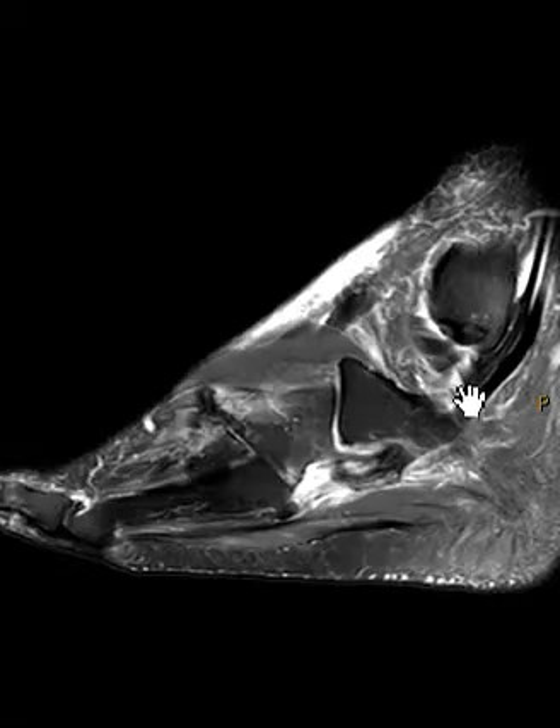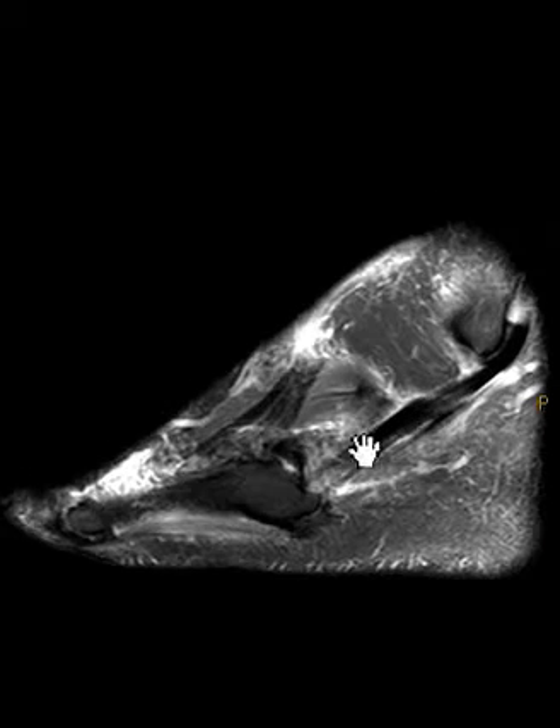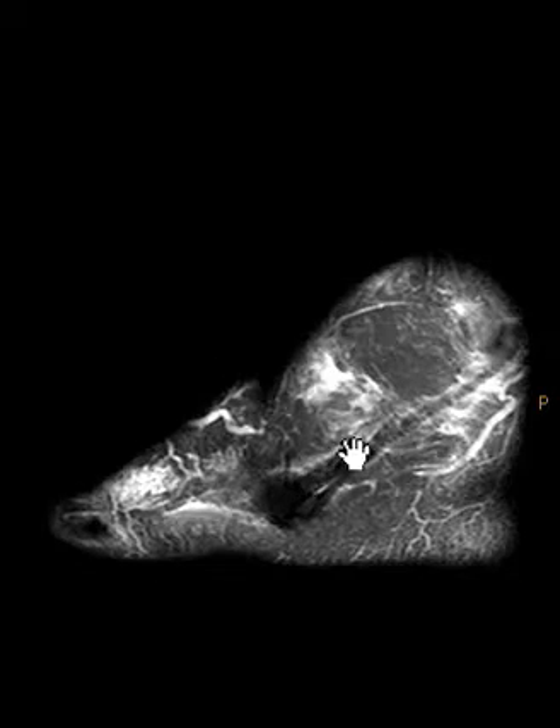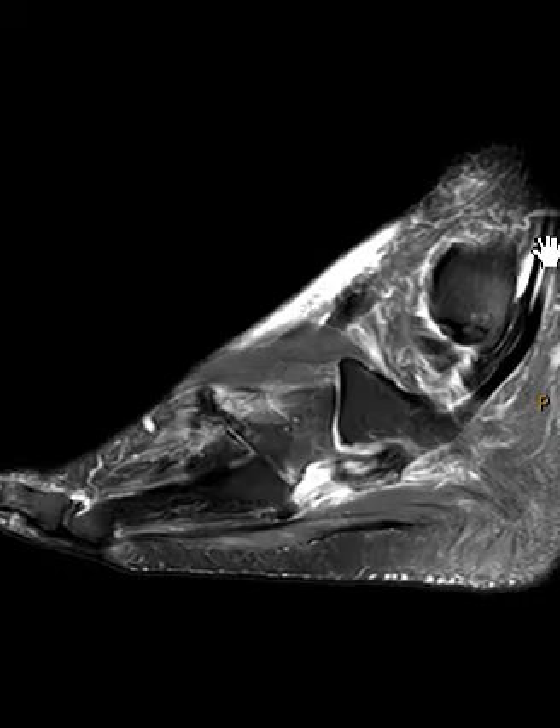As they go around the back of the fibula here, we see the peroneus brevis. It's a little foggy, a little thicker than we'd like. We're going to follow it down and it's going to attach at the base of the fifth metatarsal here. It looks like it's not torn, but it does have some mild tendinopathy and some fluid in the tendon sheath — tenosynovitis.